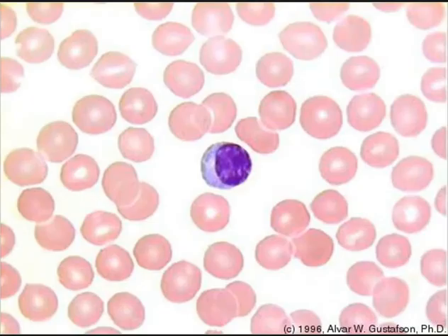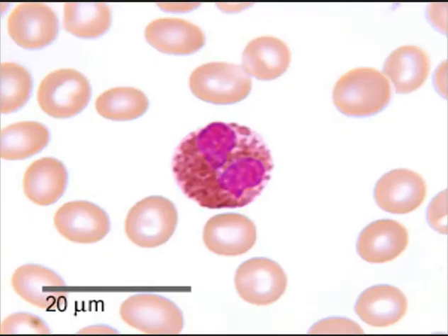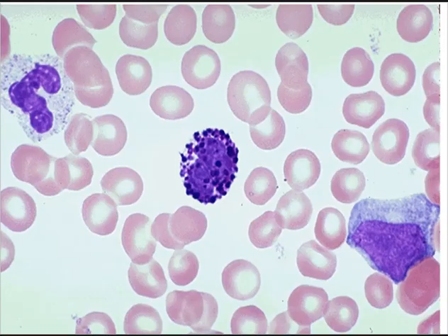This one, your RBCs again. Who is this? Yes, your small lymphocytes. And this? Of course, the large lymph. They differ a bit, but basically they are the same. Who is this with your orangey granules? Of course, we have your eosinophils. And this one? Yes, your basophil. Very good.